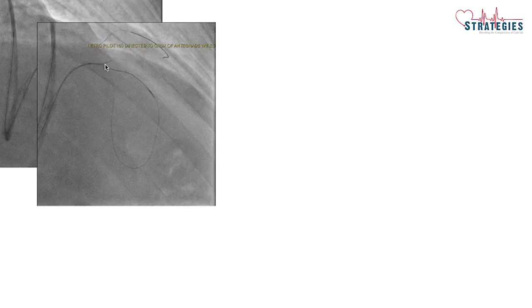So at this stage, I have to take an antegrade wire. So I took an antegrade Gaia with a microcatheter, and I tried sending the Gaia wire into the proximal LAD for antegrade preparation. But the Gaia wire was repeatedly going into a diagonal. So what I did, this is a second small diagonal, so I passed this Gaia wire into the second diagonal.